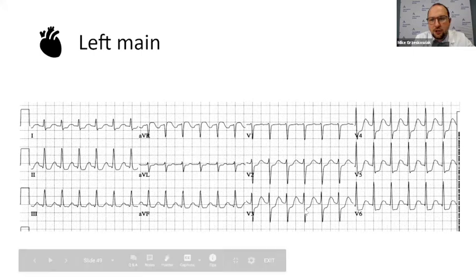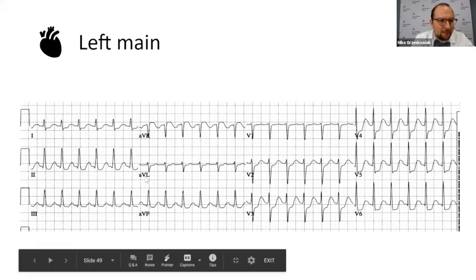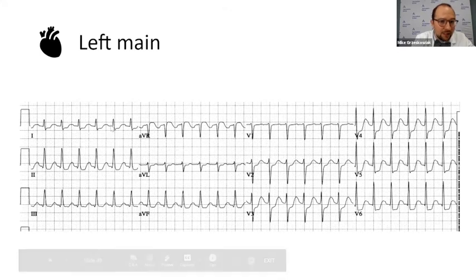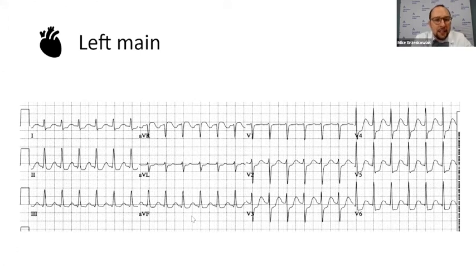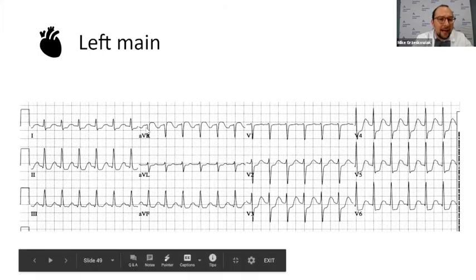So you see them here — V2 through V6 all have ST depressions. The lateral leads, lead one and AVL, have ST depressions, and you also see ST depressions in the inferior leads. This is an EKG to burn in your memory, because you might get a patient with chest pain and think they just have diffuse ST depressions — not that bad — but then not recognize a small ST elevation in AVR.